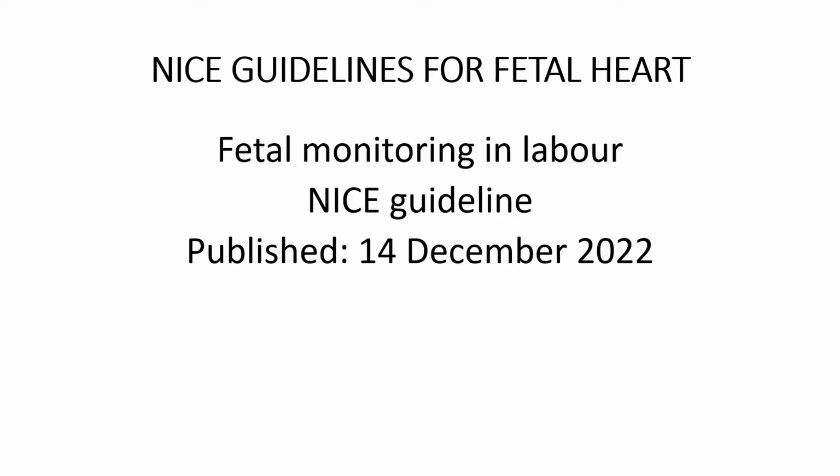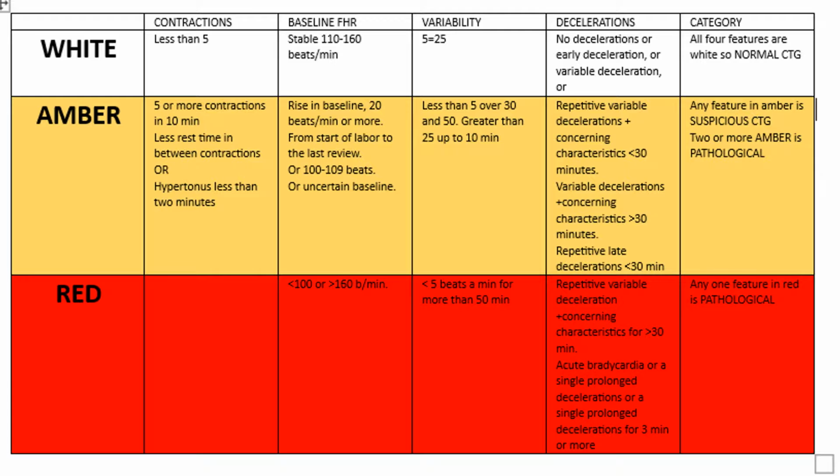Now, the National Institute for Health and Care Excellence in the United Kingdom is a body that issues recommendations and guidance, which is based on evidence and developed by independent committees, including professionals and lay persons, and consulted on by stakeholders. The guideline for fetal heart rate monitoring was published in December 2022, and some changes have taken place for better understanding and communication and reaction to CTG recording.